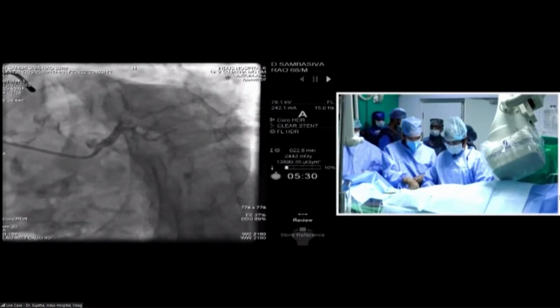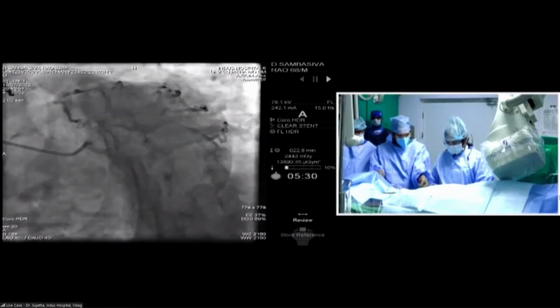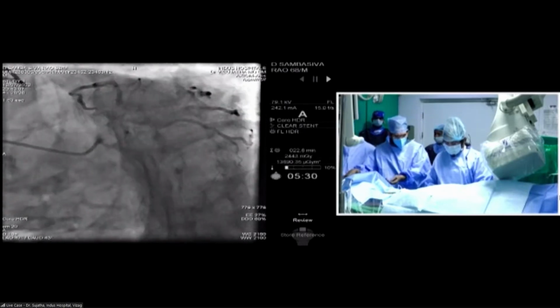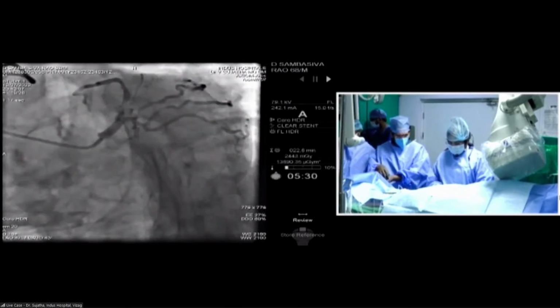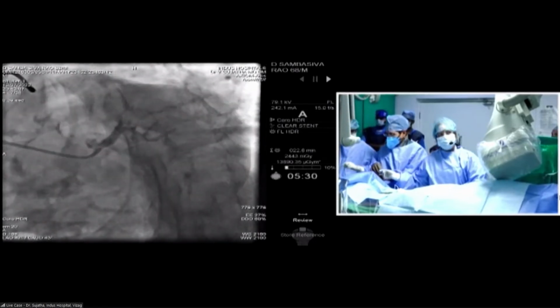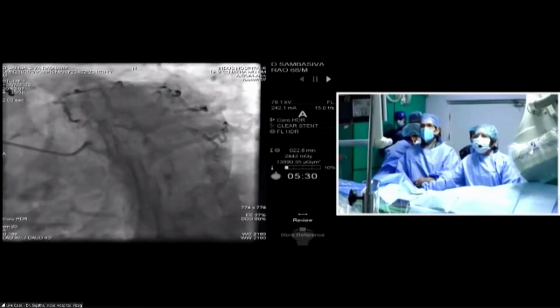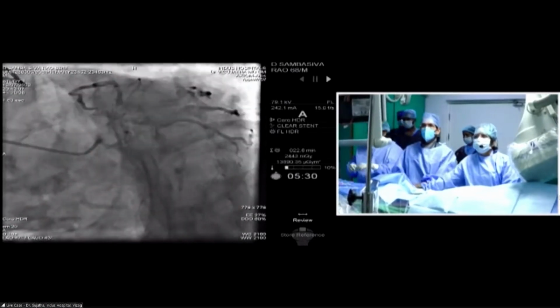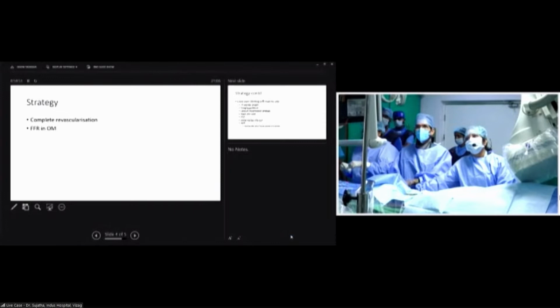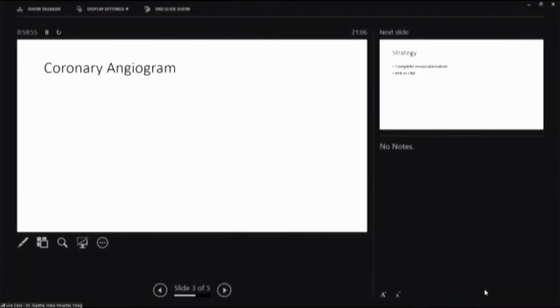Okay. Basically, madam, if you have a doubt of stenosis severity, then you think of FFR, be it ACS or chronic. Here, I think the lesions look pretty tight. LAD is definitely tight. Distal LCX also looks tight. Madam is asking about OMs, I think, OM1 and OM2. So what would your approach be? They feel it looks tighter, they're saying.